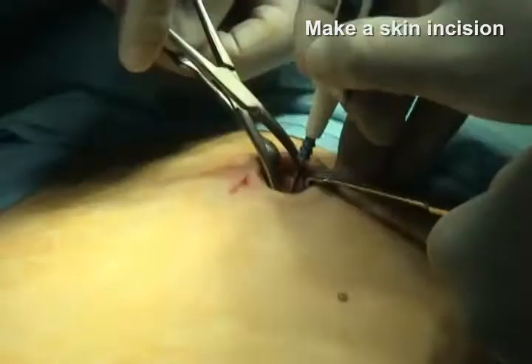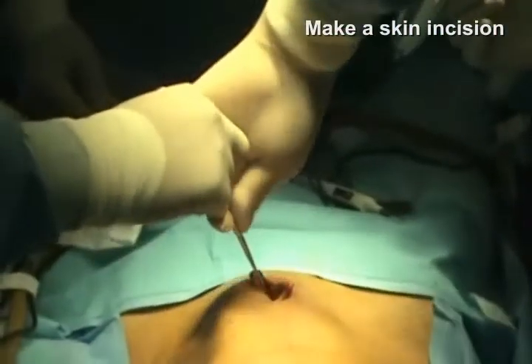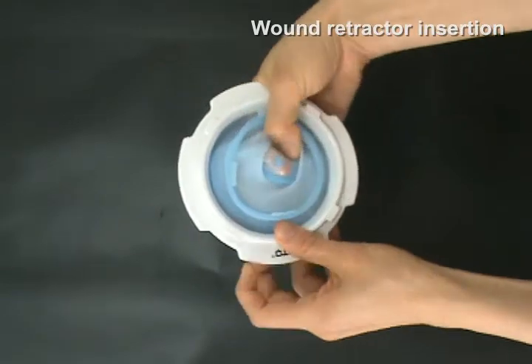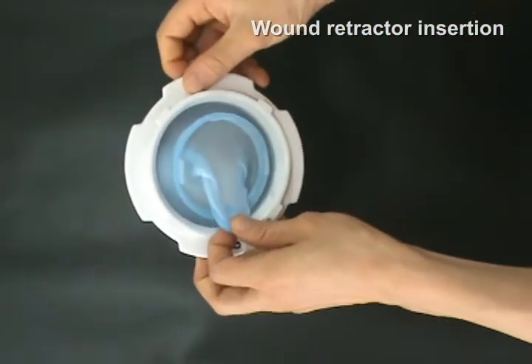First of all, you make a skin incision. After you make a skin incision, you insert the wound retractor. In detail of the wound retractor insertion, you flip the lower retractor ring upward through the hole using fingers.